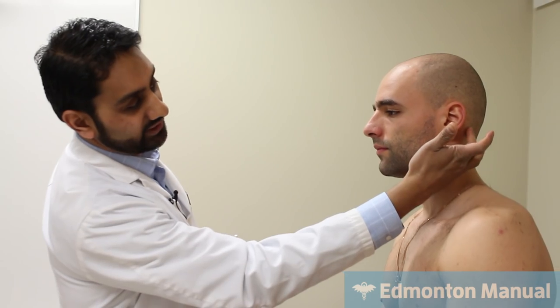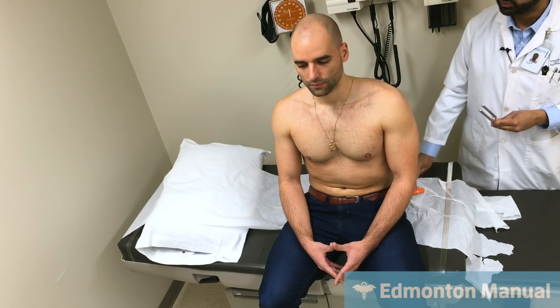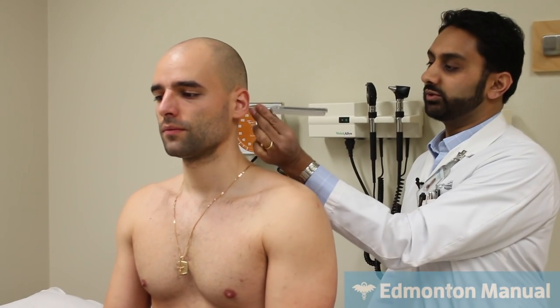But then there is Rinne's test. And in this test, what you're doing is you're actually testing both the bone conduction by placing it on the mastoid as well as air conduction outside the ear. And so the way you do this is, again, you hit the tuning fork. And what I'm going to do is place the tuning fork on the mastoid after I've struck it. And then I'm gonna ask the patient to tell me when he no longer hears the sound. So please let me know when you no longer hear it.